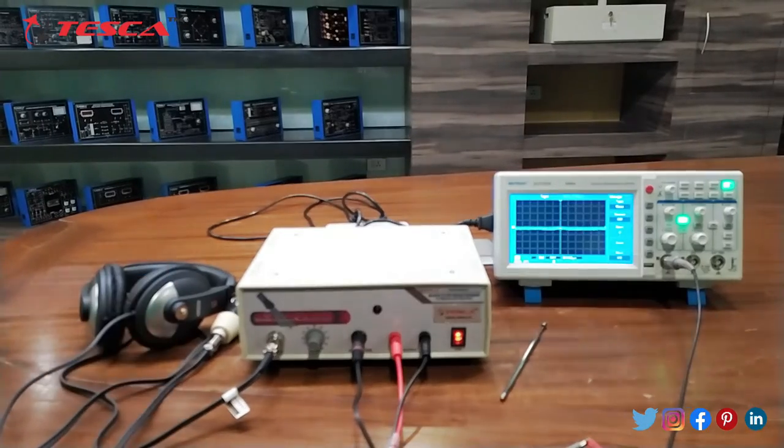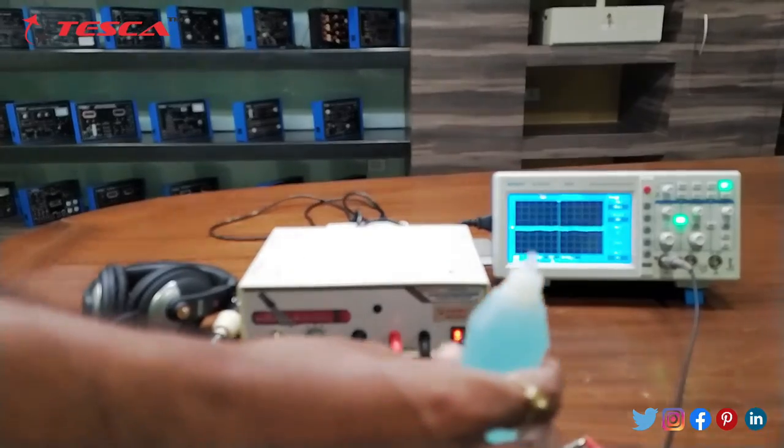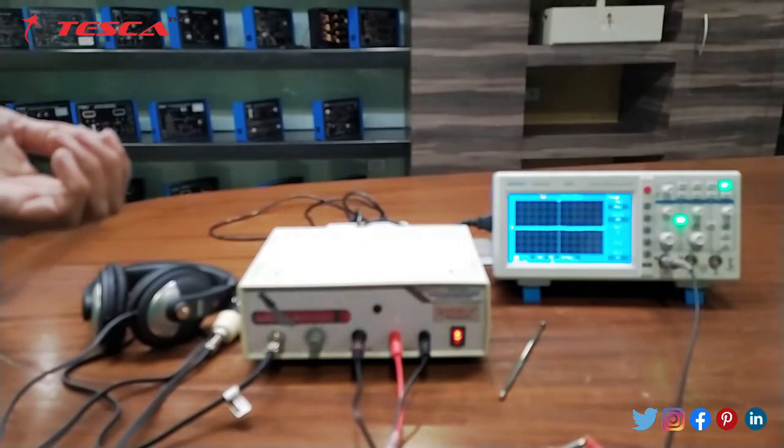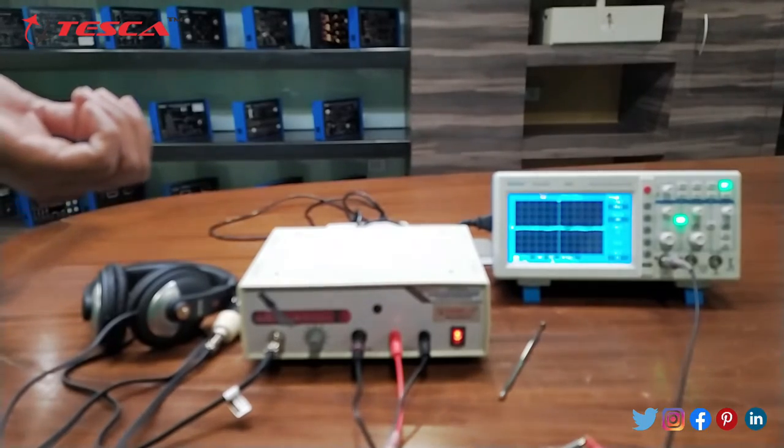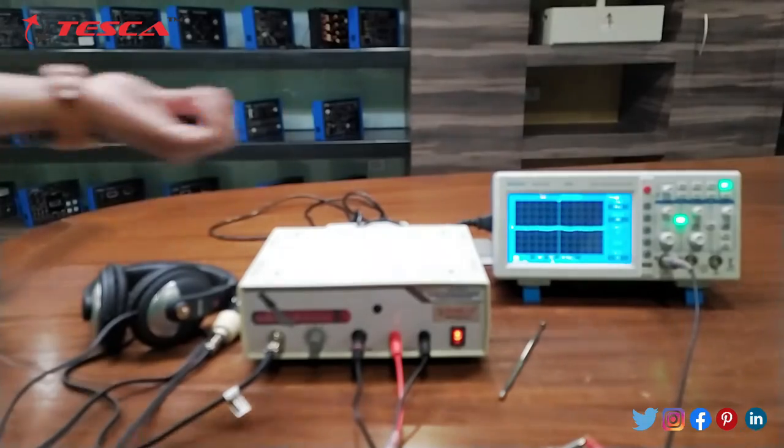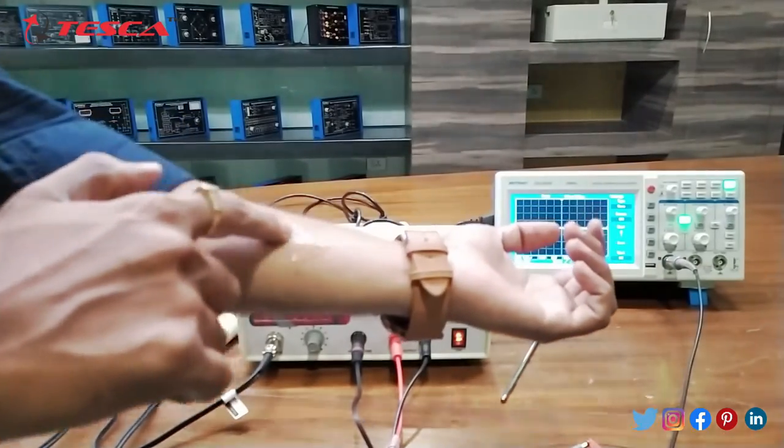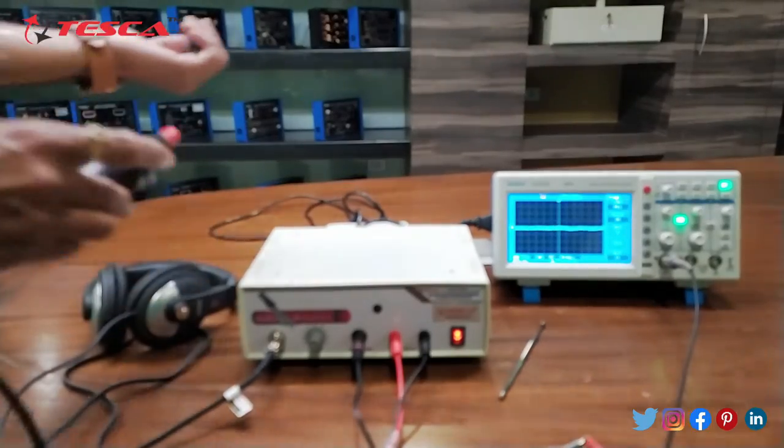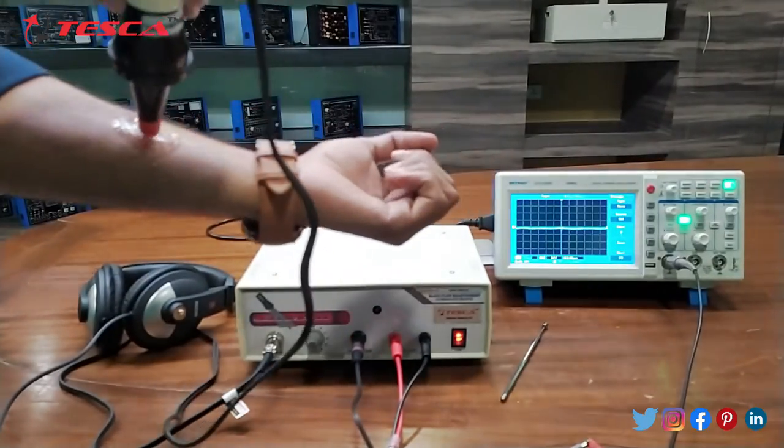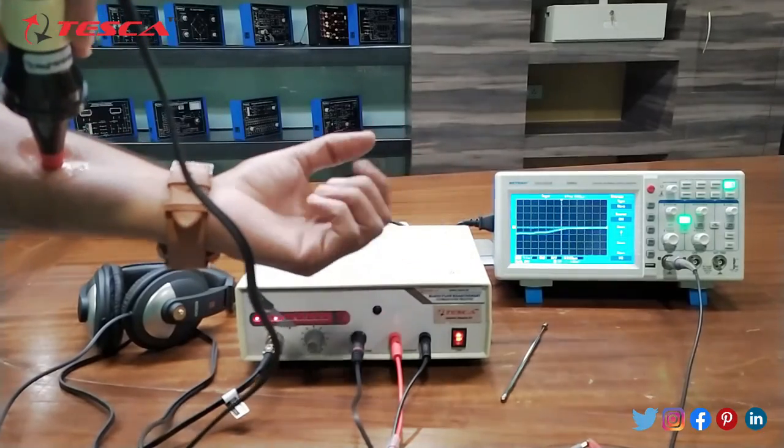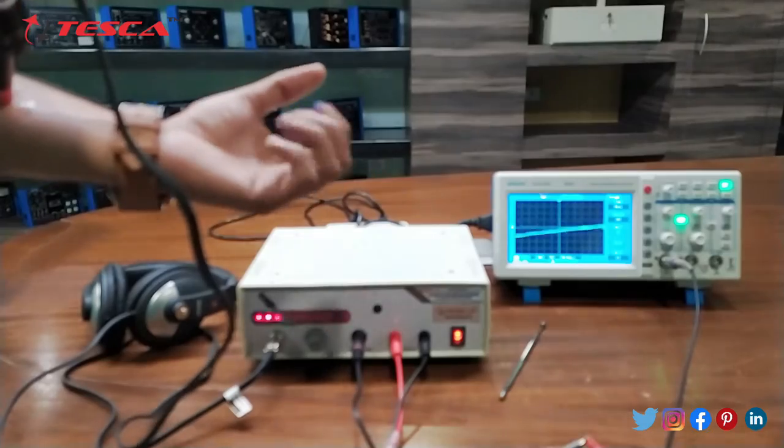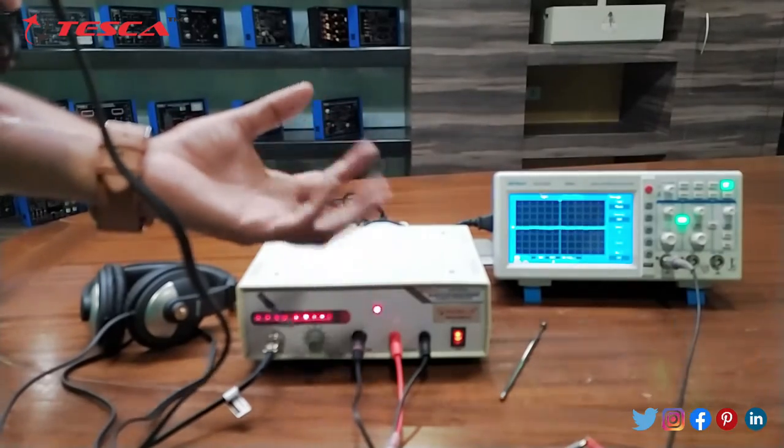Now we will measure the blood flow. For that we will apply this gel on our hand. And like this. Then we will take the transducer and we will put it on our hand.